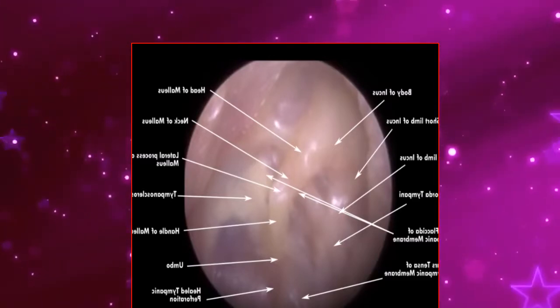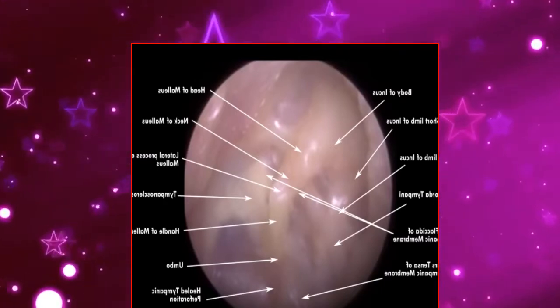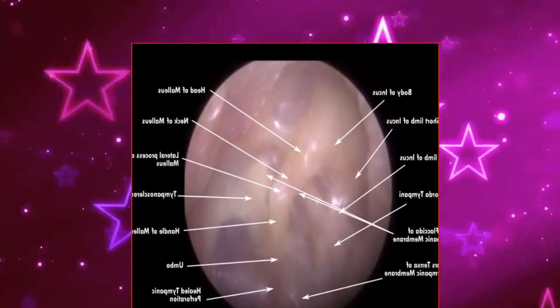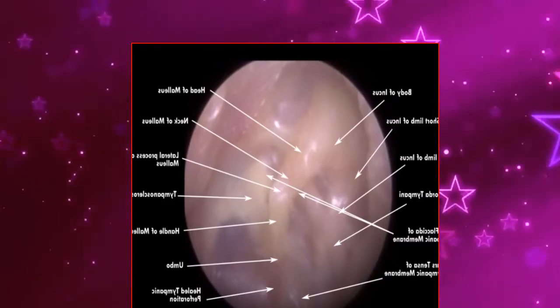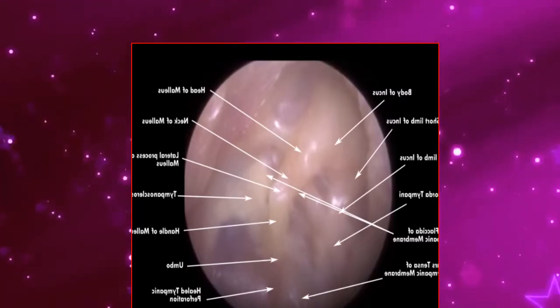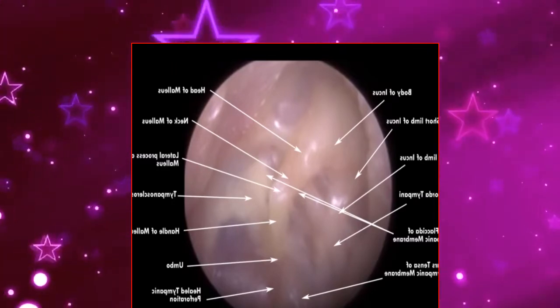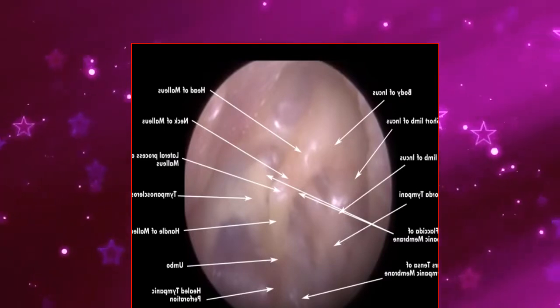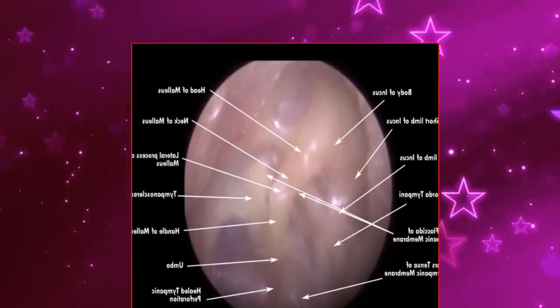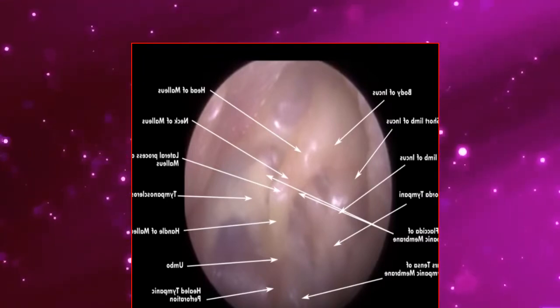The patient did report to me that they previously had a grommet as well. And a grommet is designed to ventilate the middle ear. So when that eustachian tube is blocked, because air can't enter the middle ear via the back of the nose, a hole is then punctured into the eardrum, and any fluid that has accumulated that can't drain away from the eustachian tube is vacuumed and suctioned out. And the ENT surgeon then puts a ventilation tube called a grommet, also called T-tubes, and that allows air to enter the middle ear via the outer ear canal as opposed to the back of the nose.